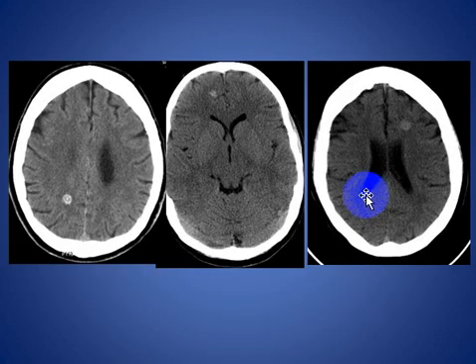Here, this is a different patient with cavernous angioma on the CT scan, on the right frontal, left frontal, and on the right side here.